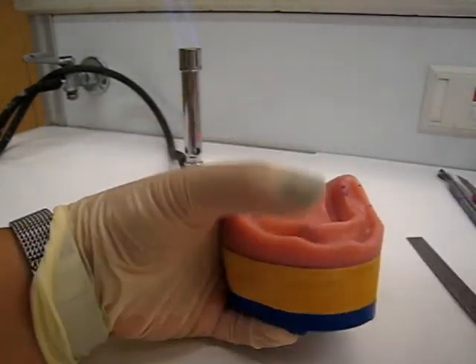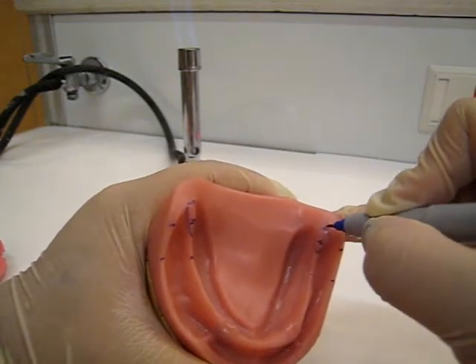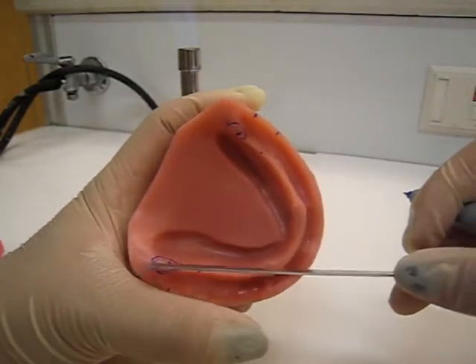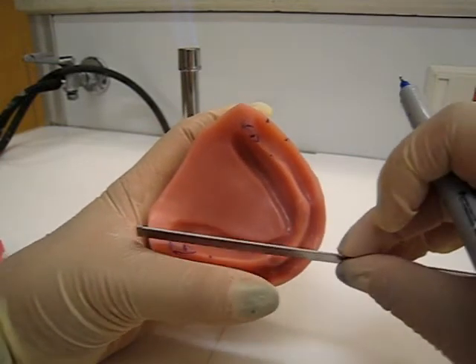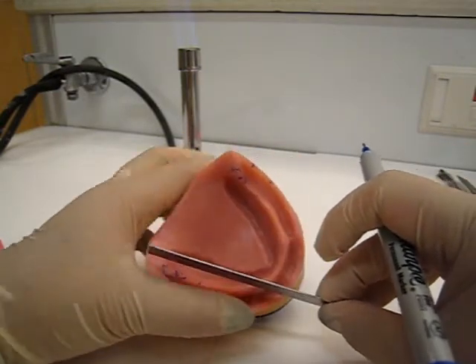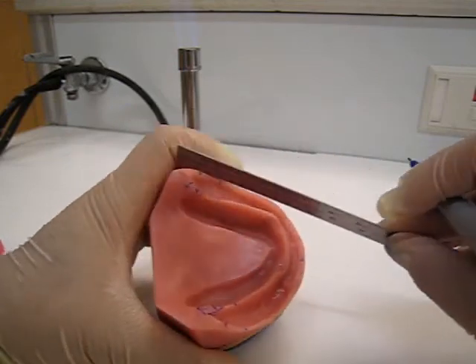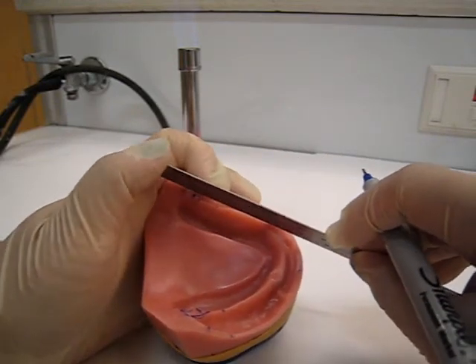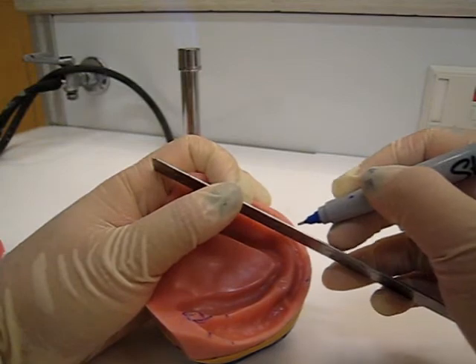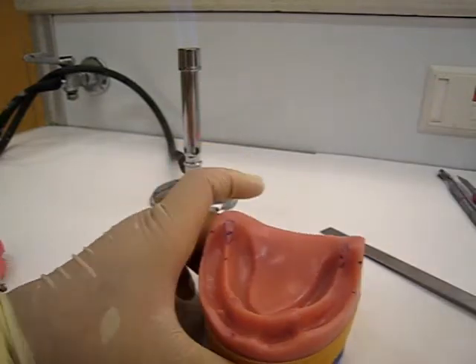Next, what you're going to do is mark through the retromolar pad. You're going to trace the alveolar ridge. Take your ruler, look down, and go through the canine area. Follow the alveolar ridge and then mark your line. On the other side, remember it's kind of curved, so just average it - about right here. So you have those markings.